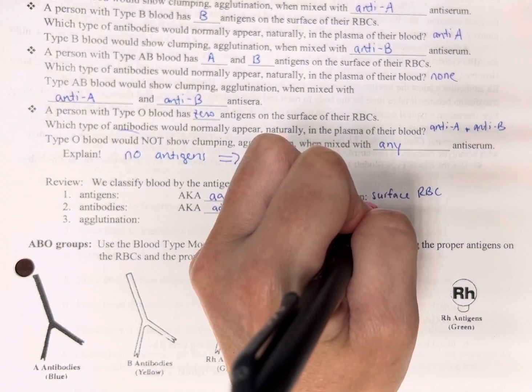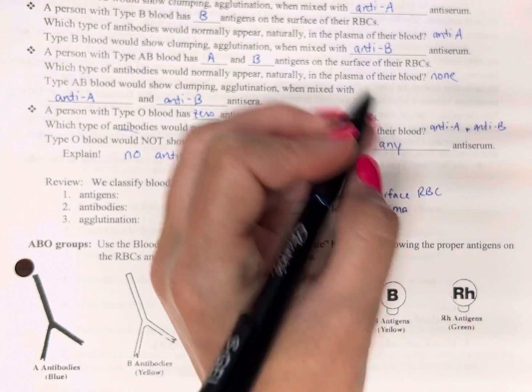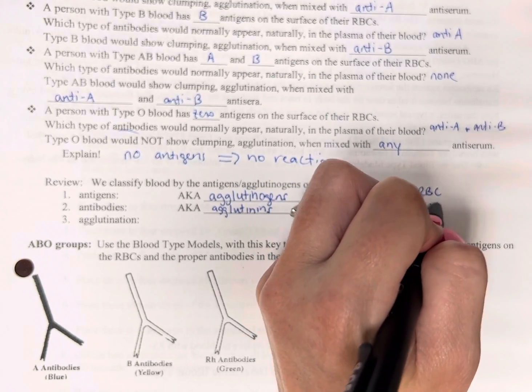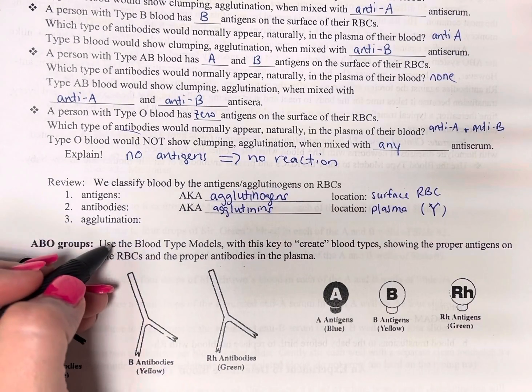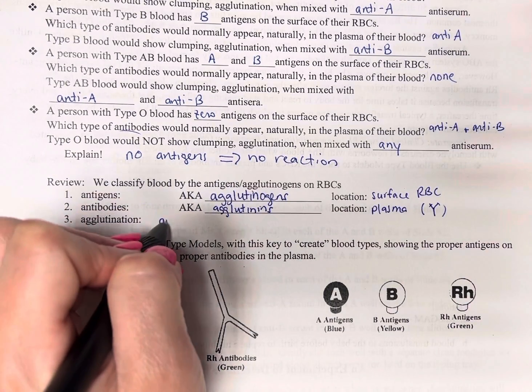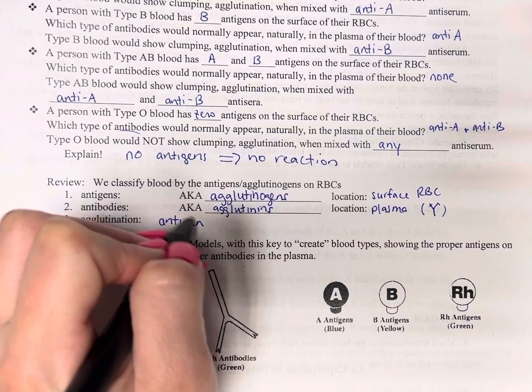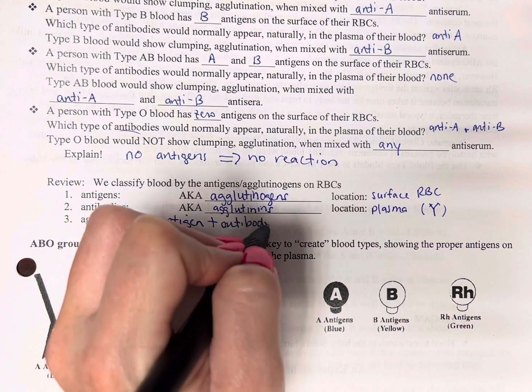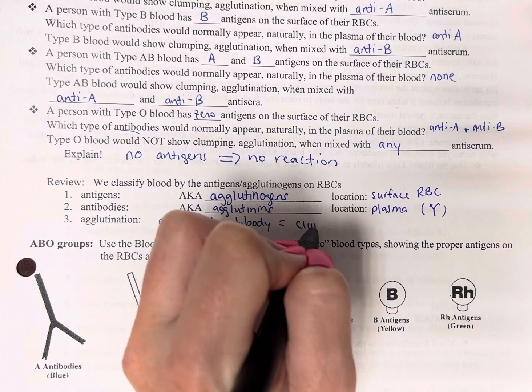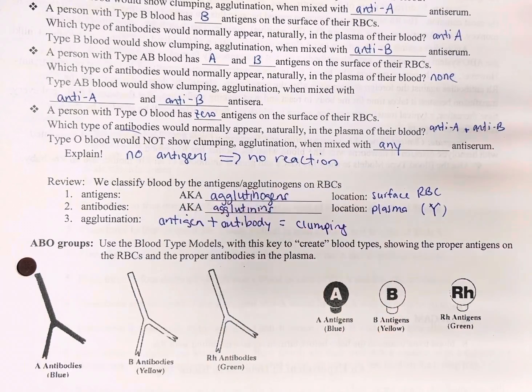They're located in the plasma of the blood, and they are the ones that are shaped like Ys. That looks like a Yellowstone logo, but it's not. So agglutination means antigen plus antibody equals clumping.